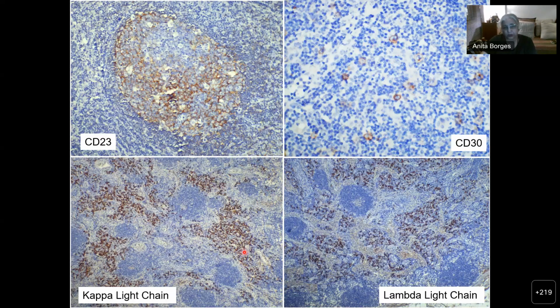And I showed you the plasma cells with the MUM1 stain. You can use CD138, which will also pick up the plasma cells. And this is how you can stain for kappa and lambda light chains. You can either use immunohistochemistry, or increasingly, at least in my lab, we are using in situ hybridization. It gives you a more specific and a brighter stain. And this is the kappa to lambda ratio.